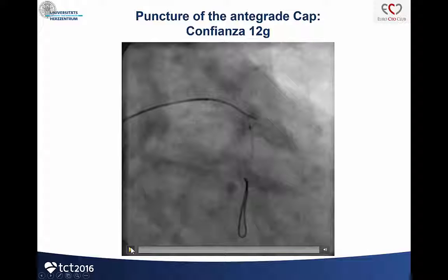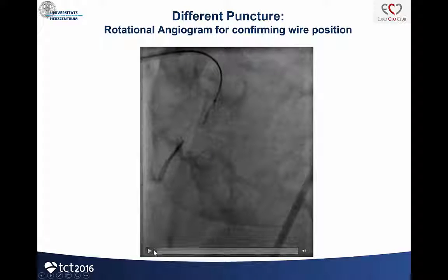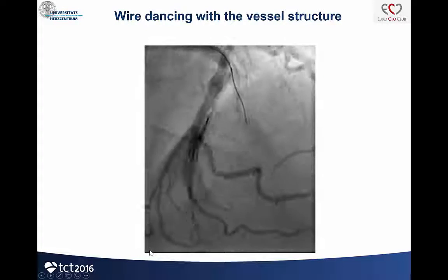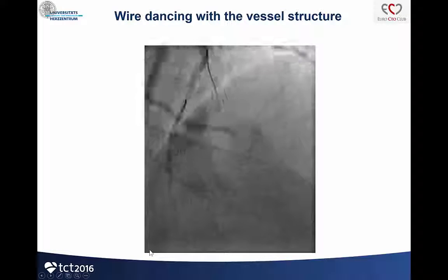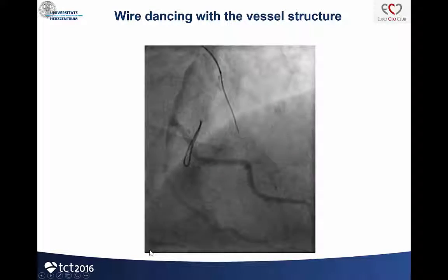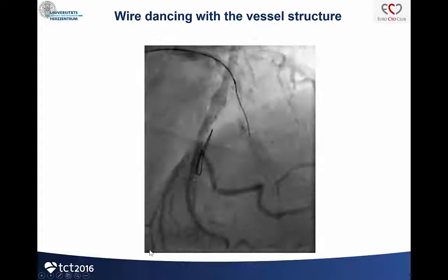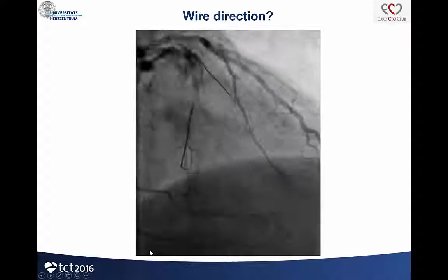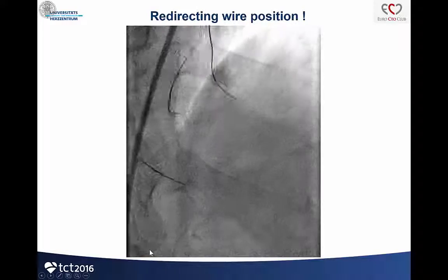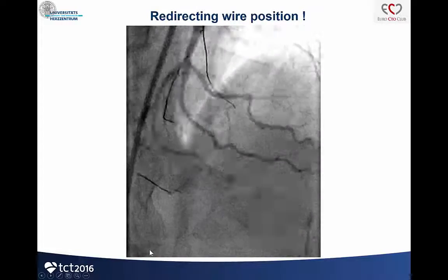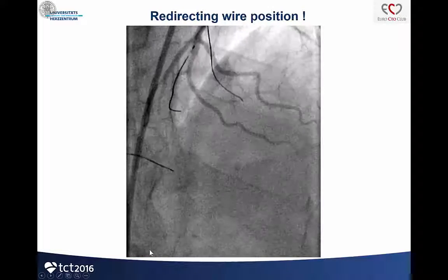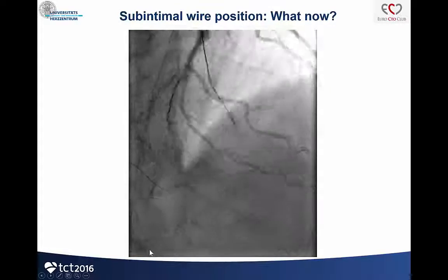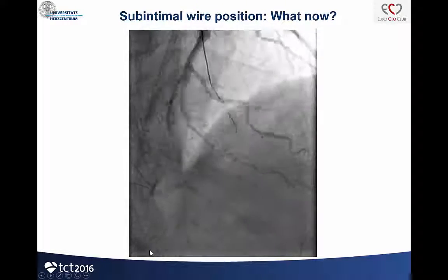I punctured without IVUS in the first setting and tried to achieve progress. The Confiancer 12-gram was not so bad and I could penetrate the proximal cap. I had a fine-cross 7-French approach. I did wire redirection and was nearly close to the distal landing zone, but not quite there. Wire redirection was not bad but not perfect. If I continue here, I will have a lot of hematoma compressing my small vessel.